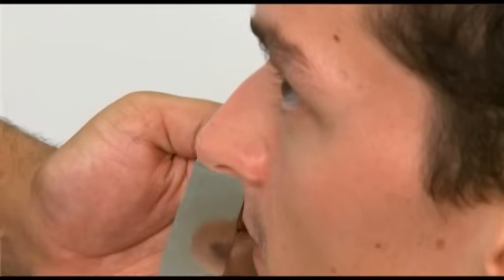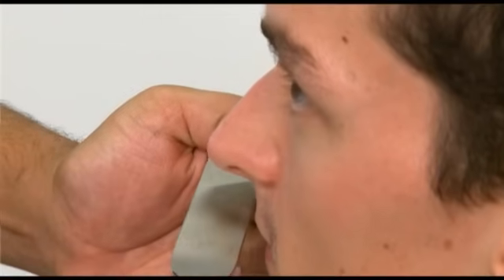Here we're looking for any nasal obstruction or any alar collapse. Nasal patency can be further assessed using a cold metal tongue depressor held underneath the patient's nose. Can you breathe out for me please? Good misting of the tongue depressor indicates good nasal patency.